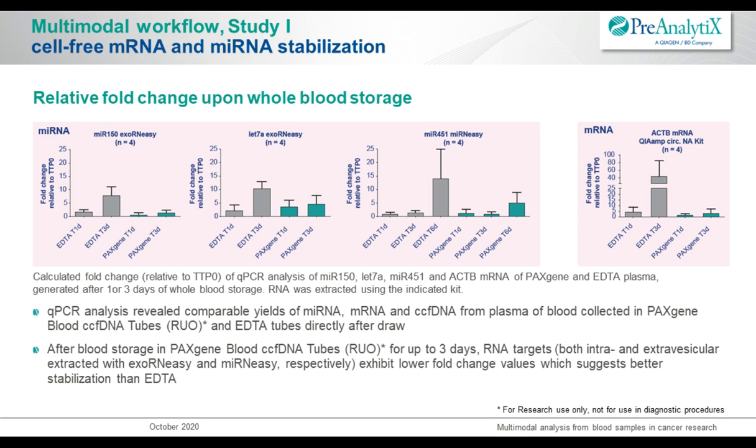And you see that the behavior is a little bit different between the different microRNAs, but overall you see that you get relatively good stabilization in the PAXgene tube up to 3 days, sometimes also up to 6 days, but always much better than what you get from EDTA.